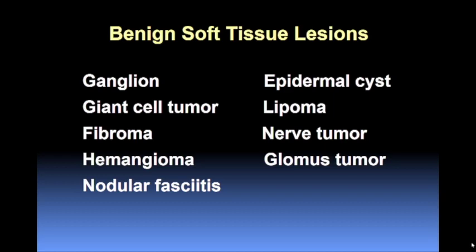But when patients present with something around their hand, their wrist, sometimes even on their forearm, ultrasound is a really good modality to sort this out. We did a study a long time ago and looked at what experienced hand surgeons diagnosed a lump and bump as, just simply solid versus cystic, versus what ultrasound could do, and they were wrong 50% of the time, so you could have flipped a coin to make a decision.